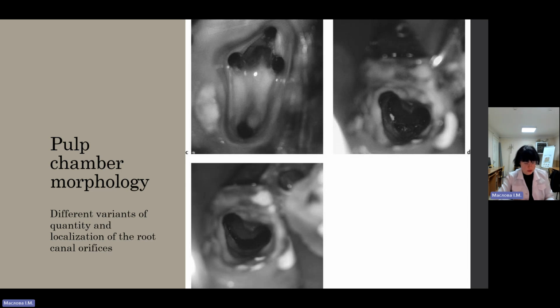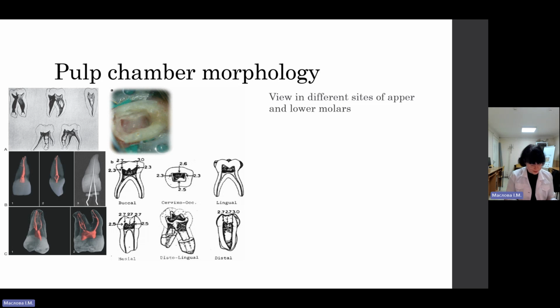Examination of the radiograph affords information on the size of the pulp chamber, the distance of the chamber from the occlusal surface. Please put your attention on the slide on the occlusal surface. And the floor of the pulp chamber in the coronal part, the angle of exit of root canals from the floor of the pulp chamber. This provides an indication of the amount of coronal third root canal modification required to obtain straight line access. Straight line access before the beginning of the curvature.